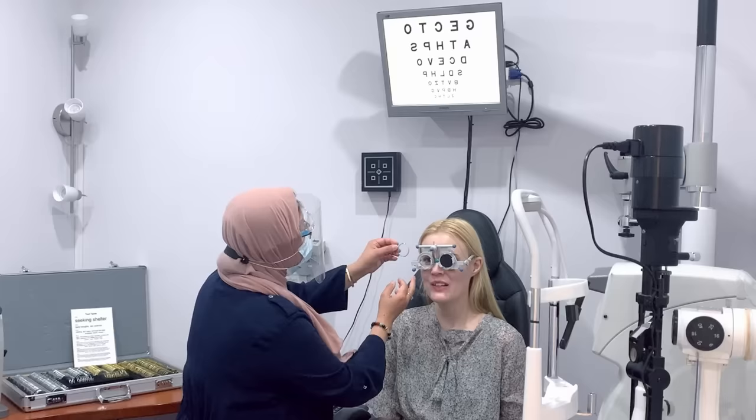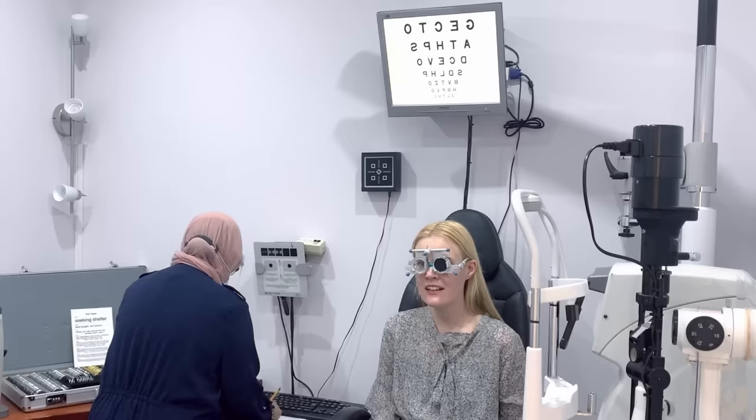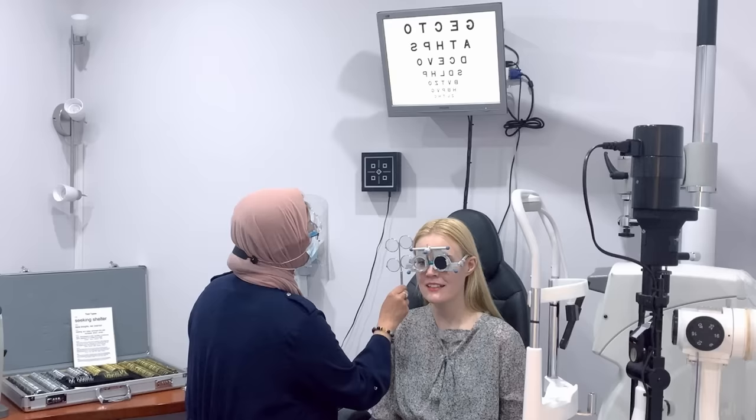Okay, so what I'm going to do is put up the prescription that was given to you in your glasses. Oh, wow. That's a lot better, isn't it? So how far down can you go now? I think I can read everything. Try the bottom. Z, L, T, H, C or G. Yeah, C. Can you still see that there? Oh, yeah, that's much clearer. And what about when I do that? Compared to that, this one's better. A bit better that way, yeah?